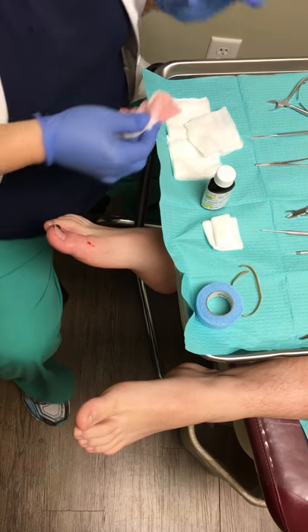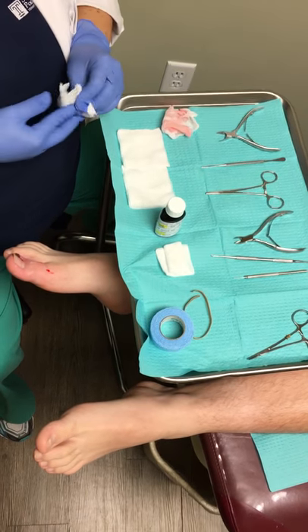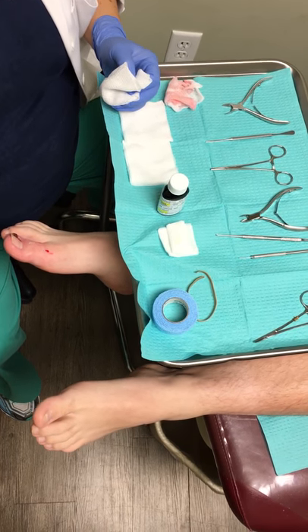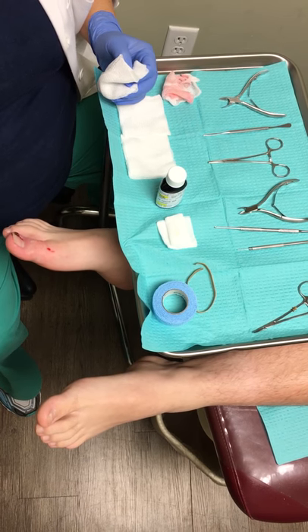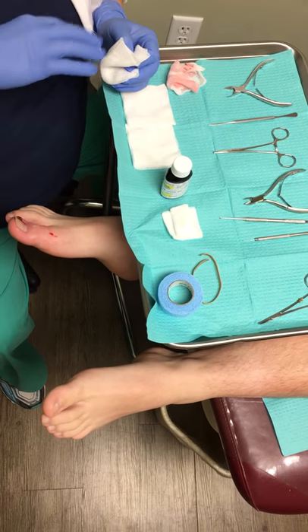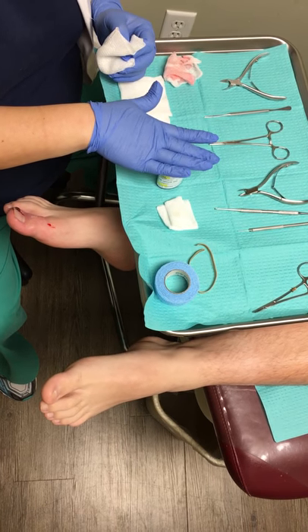I've already cleaned up the toe. The current plan is to do the matricectomy. But if I notice that there's too much infection process in here, we're going to cancel the matricectomy and just do a traditional avulsion. The reason is because if you have too much inflammation and swelling, it can affect the efficacy of the phenol acid.